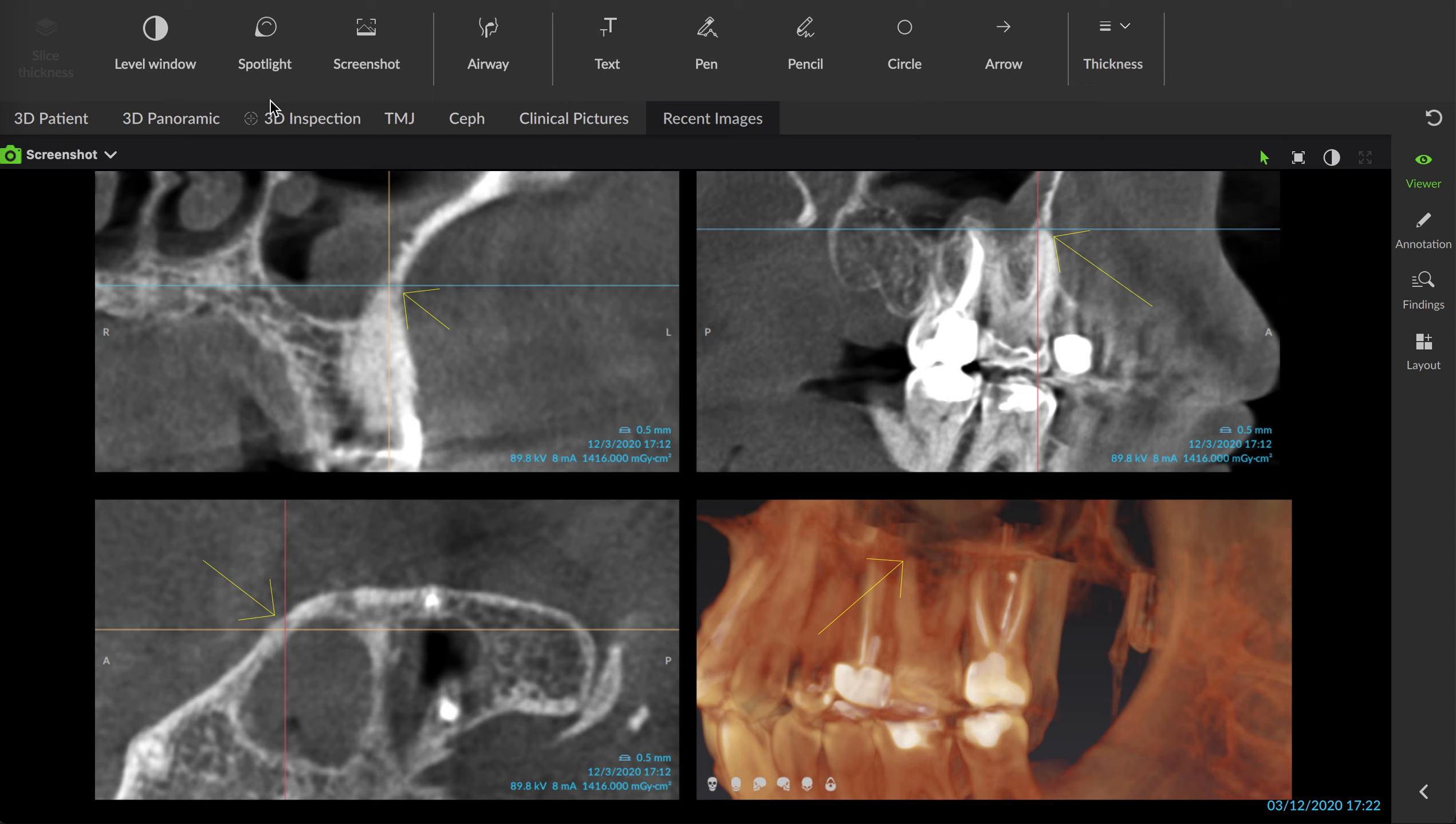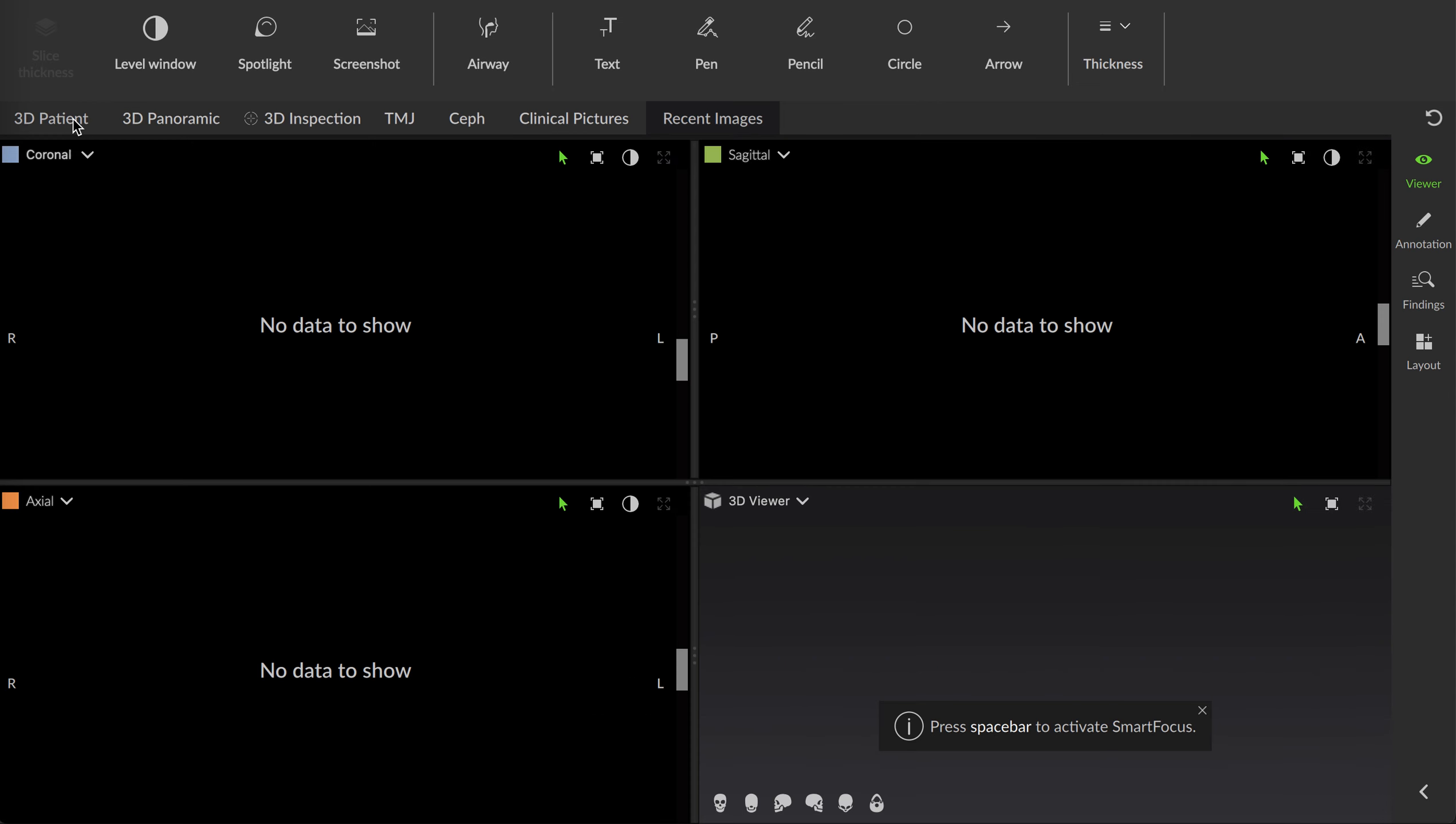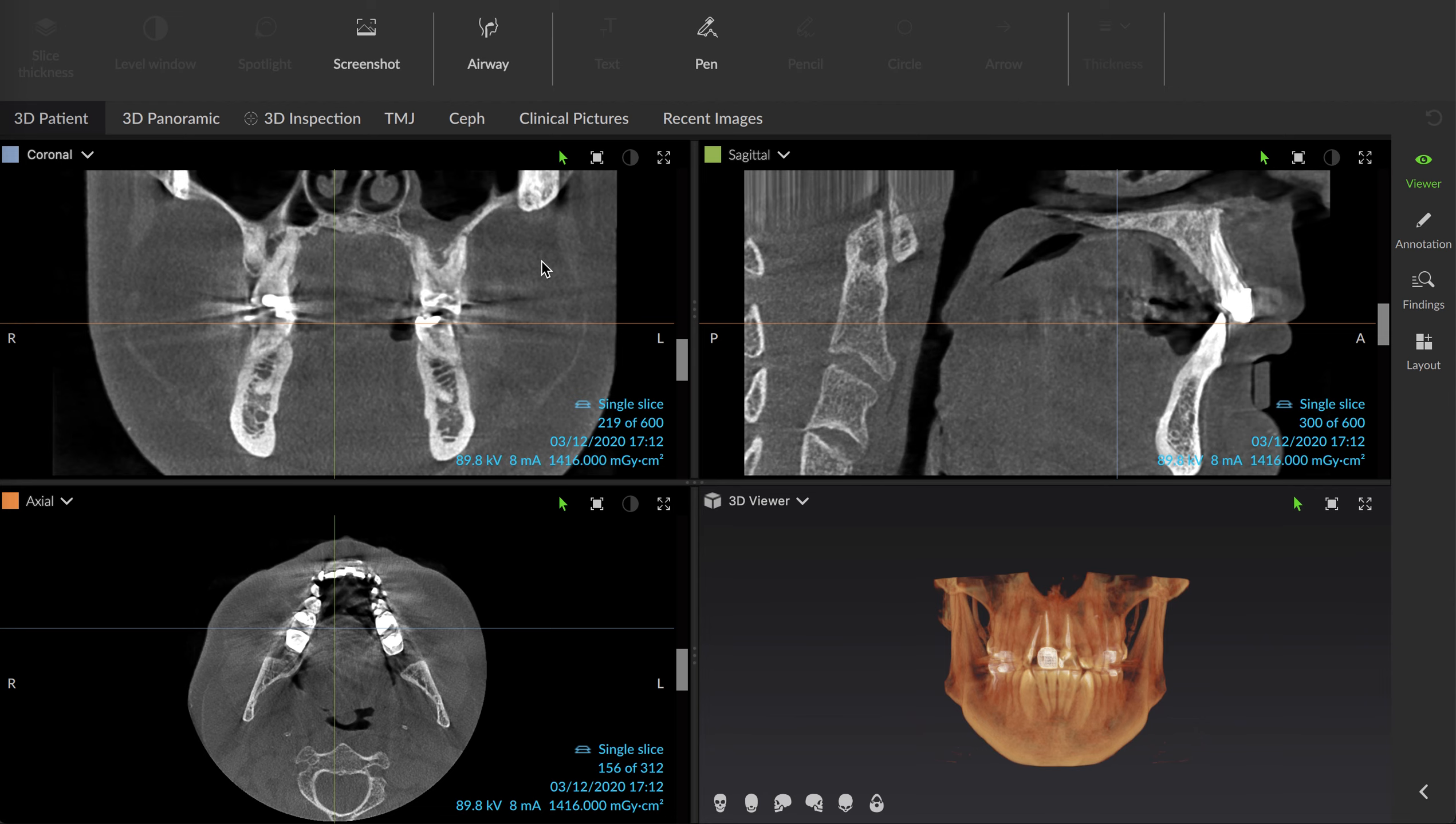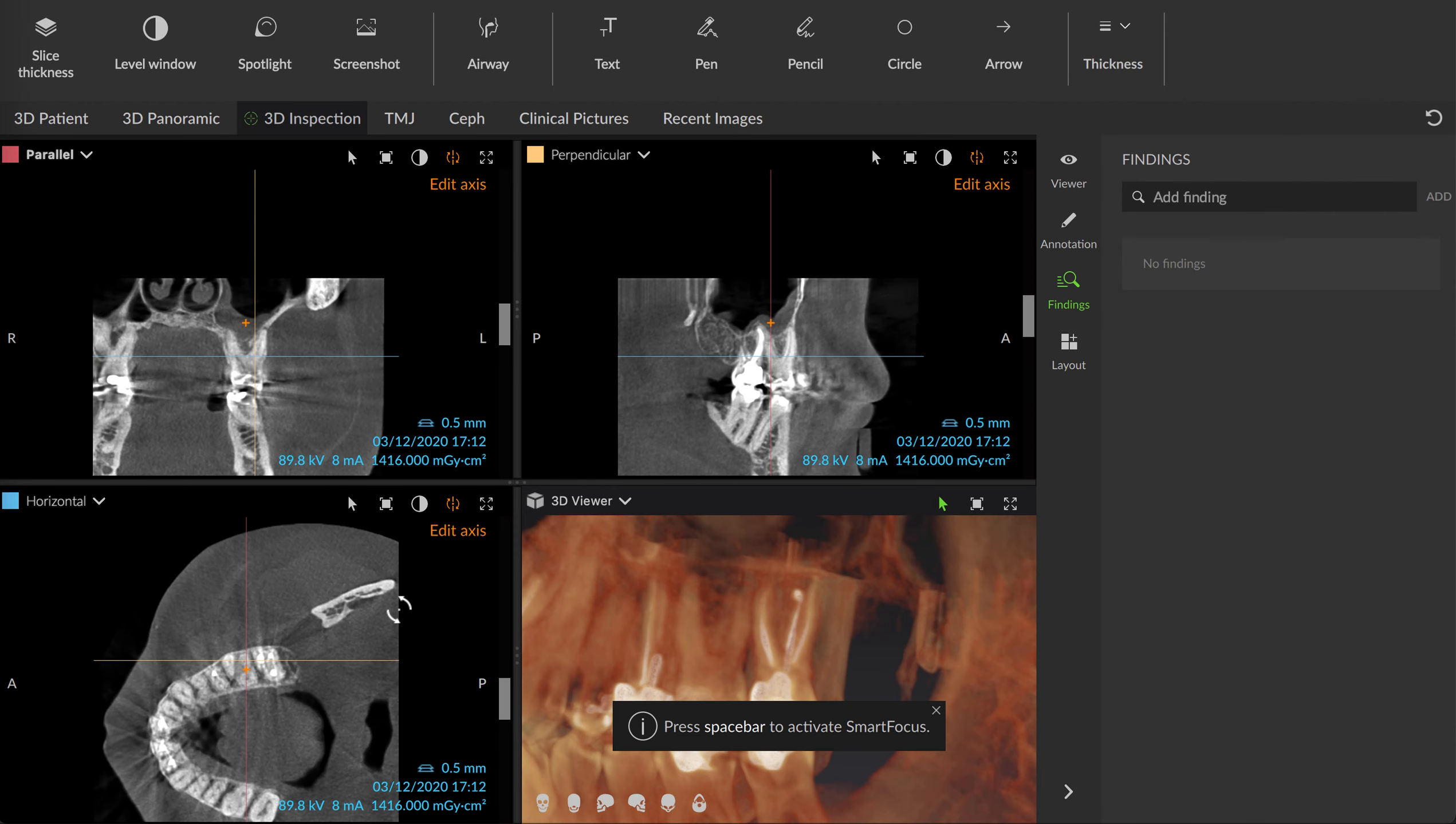I started the root canal and then I could not find that distal buccal canal. Couldn't find it. So I went back to the CBCT and pulled up the axial slice. Let me zoom in here a little bit.